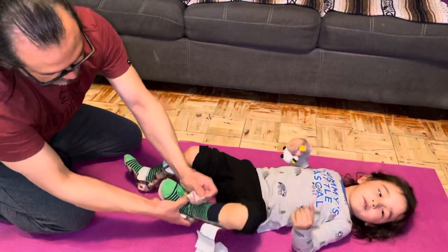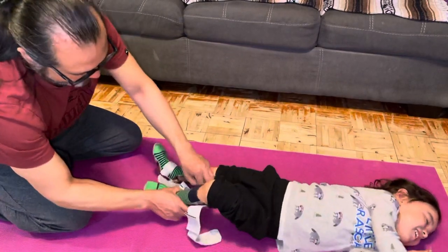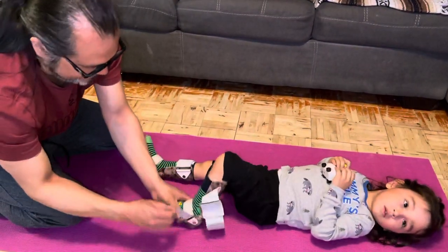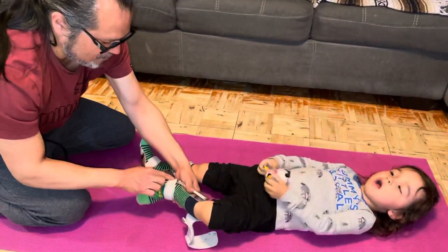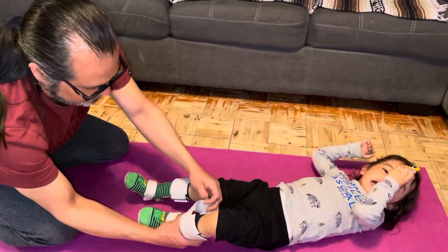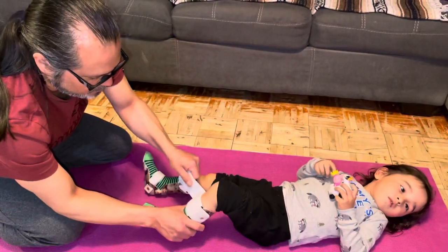With it like that, you just put it on here. And then put that strap on — just leave it on the outside, not on the inside. We just had them adjusted today, and he said to leave that strap on the outside of the plastic because it might create a pressure point.